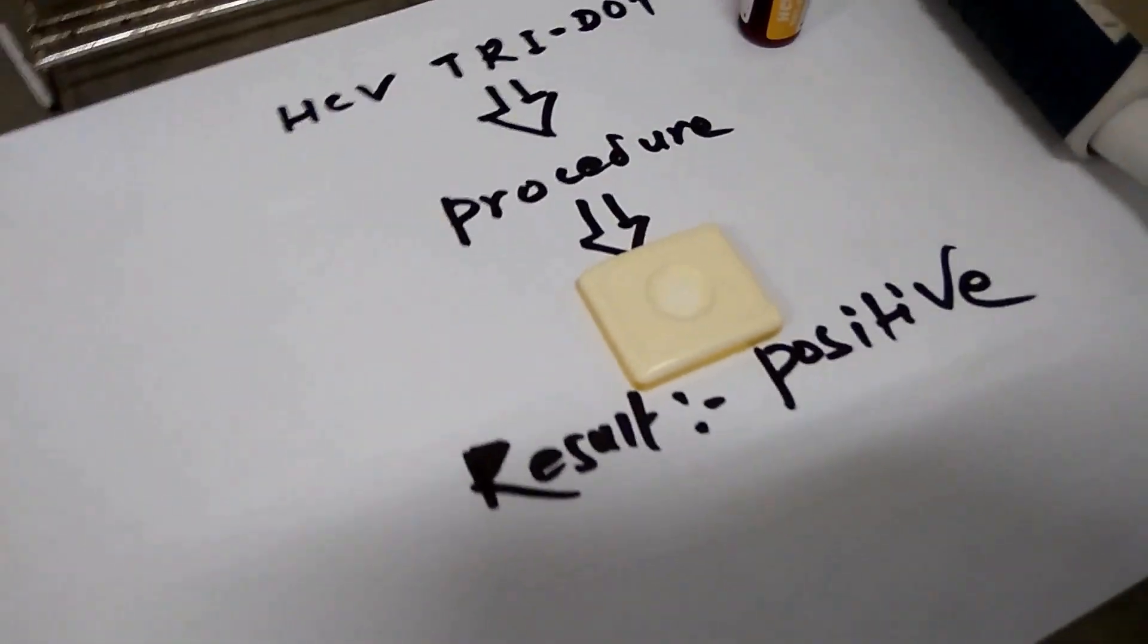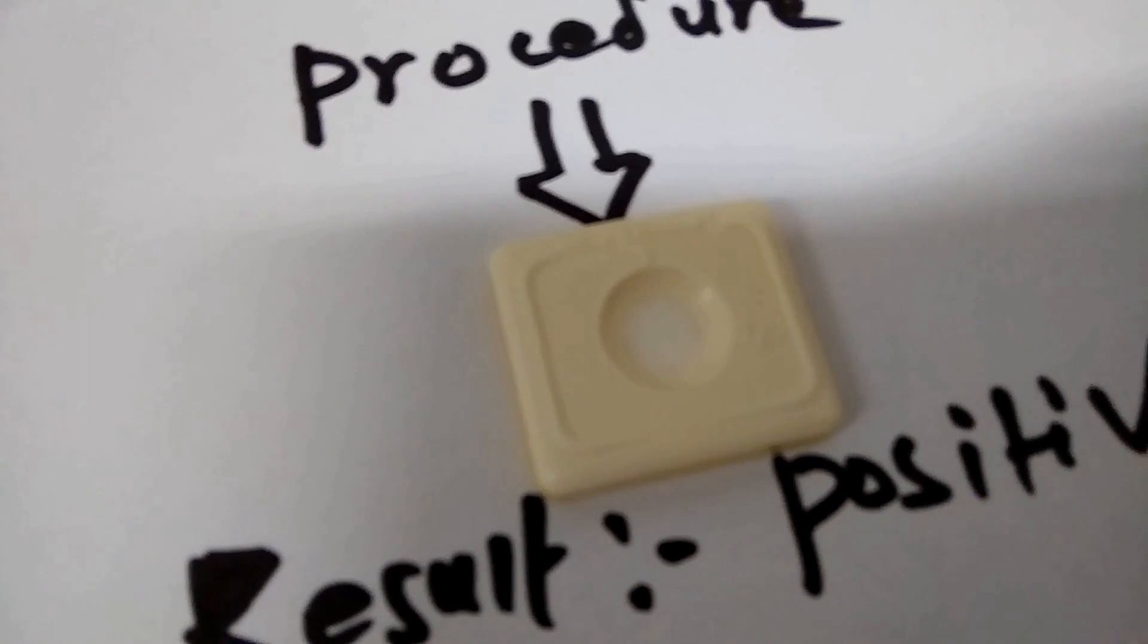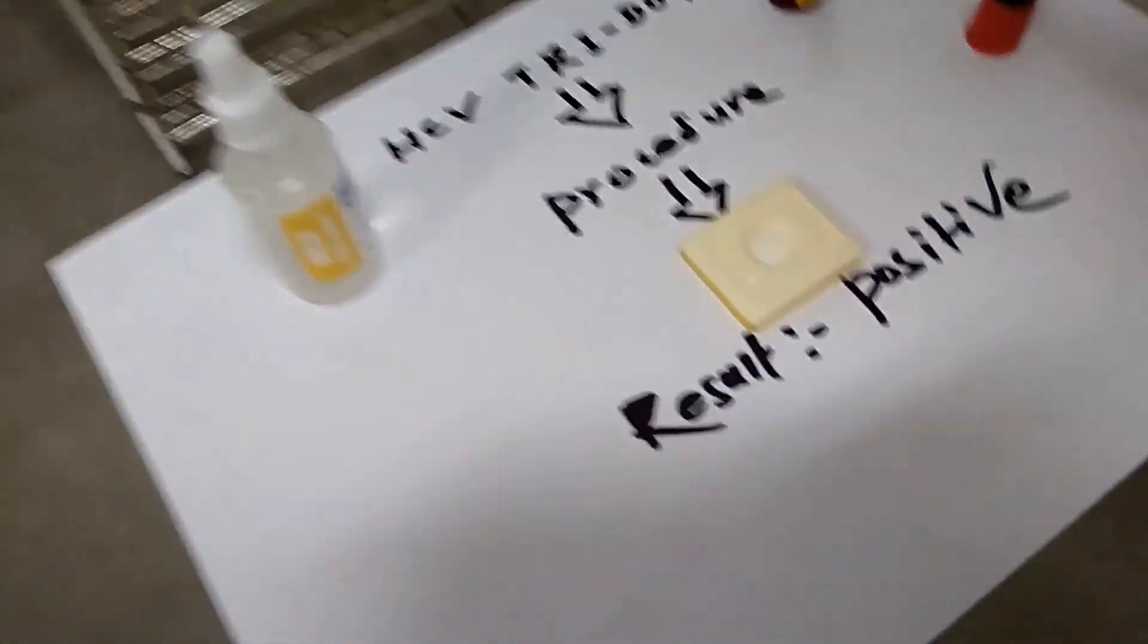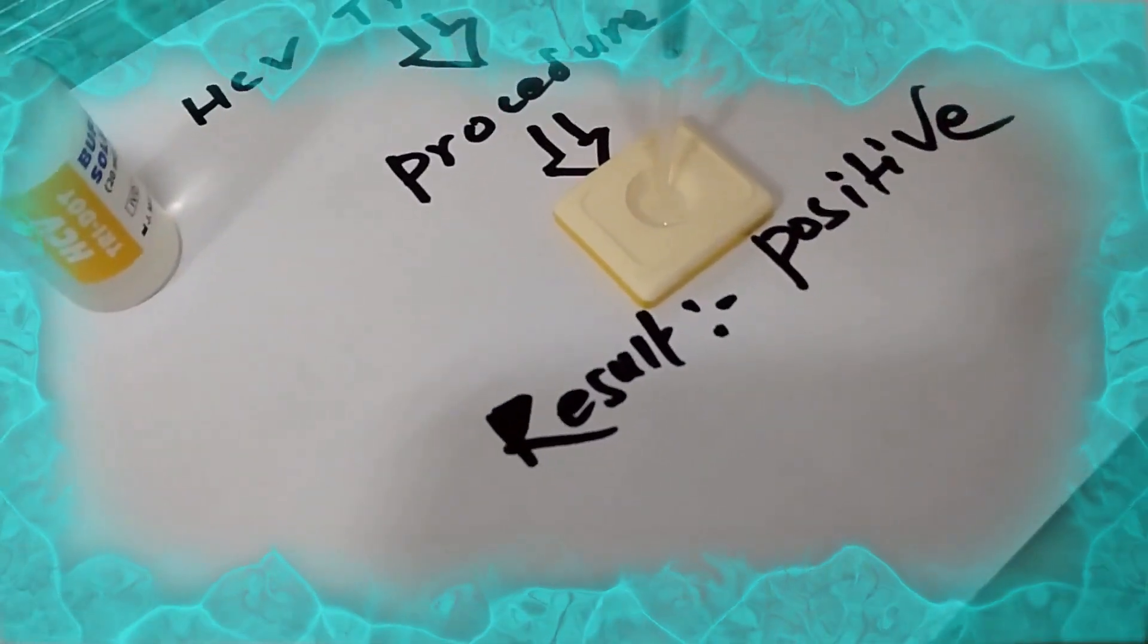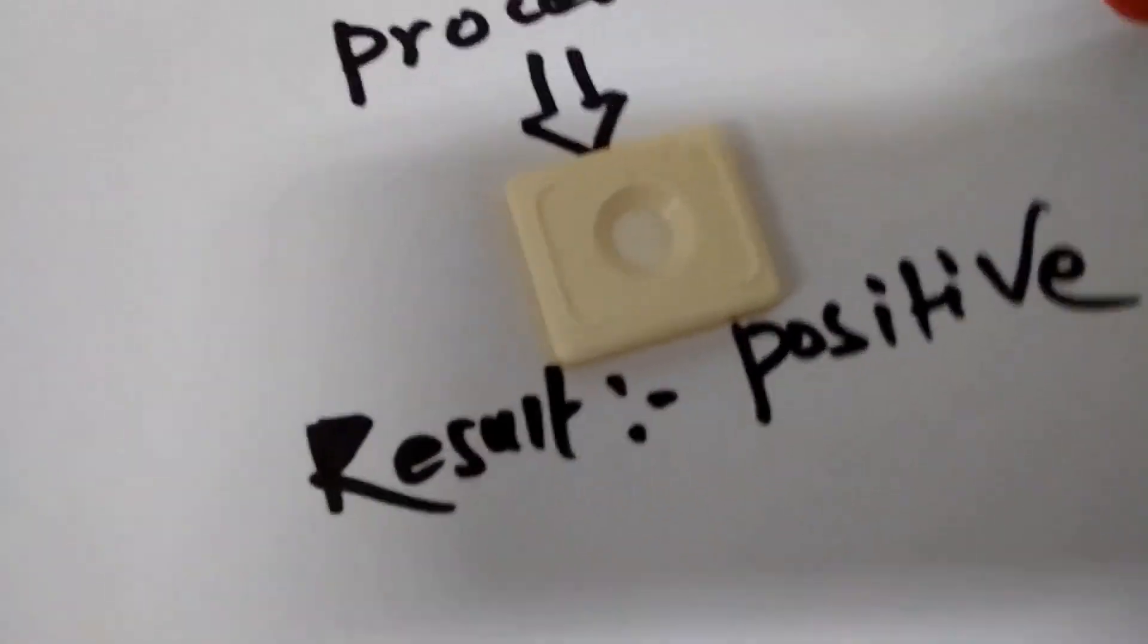Dispense 1 drop sample with provided dropper or 50 microliters with micropipette and leave for drying.